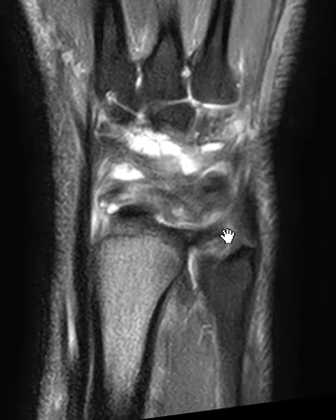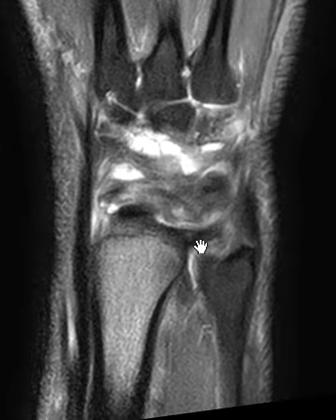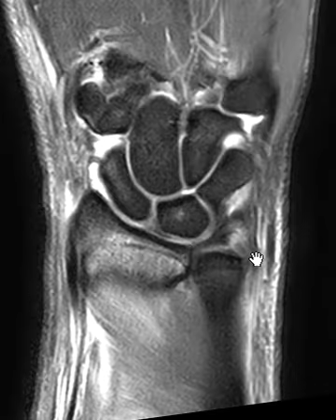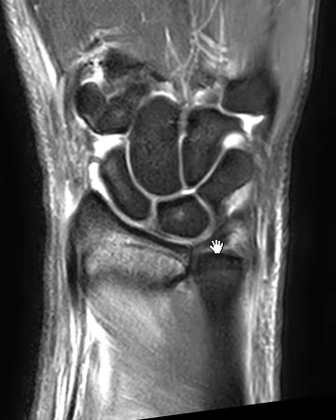If we go towards the dorsal side, we see this band here — this is called the dorsal band. They blend together and it's really hard to tell them apart. And if we go towards the palmar side, we see the palmar band over here, and the palmar band looks pretty decent.